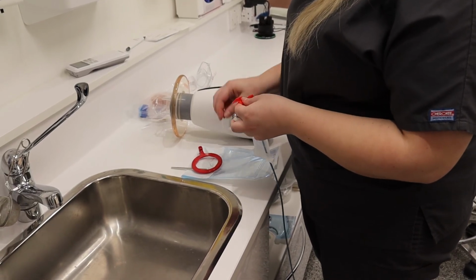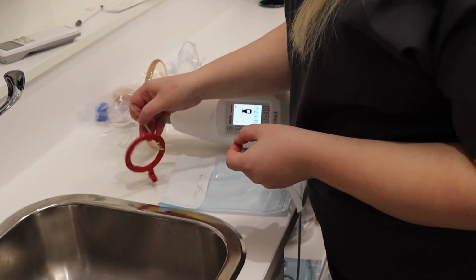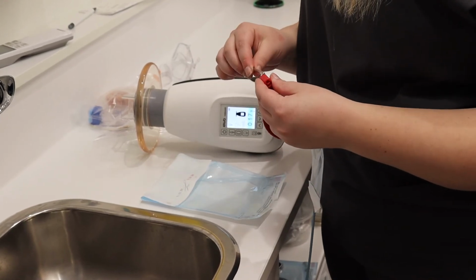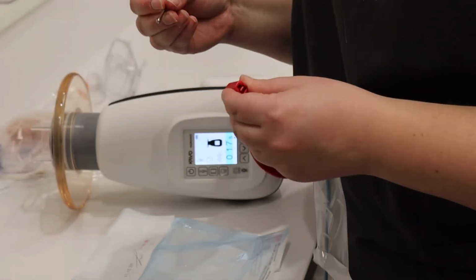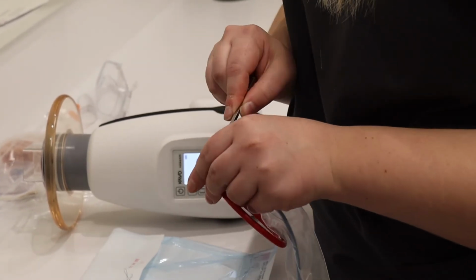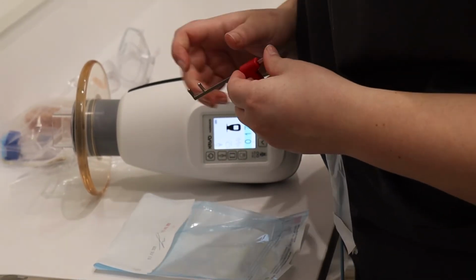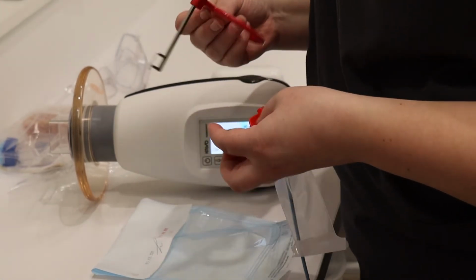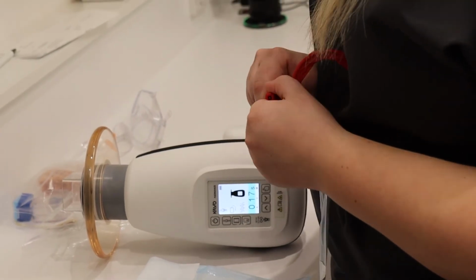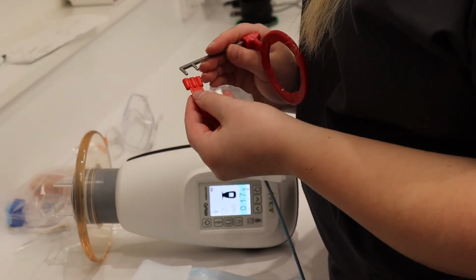The nurse is now setting up for a bite wing X-ray. You have a yellow holder for a posterior tooth long cone periapical and a blue holder for an anterior long cone periapical. Sometimes the dentist may not use the sensor holder and may ask the patient to position the sensor within the mouth, due to difficulty of having a large targeting device in the mouth, but where possible a targeting device is recommended.